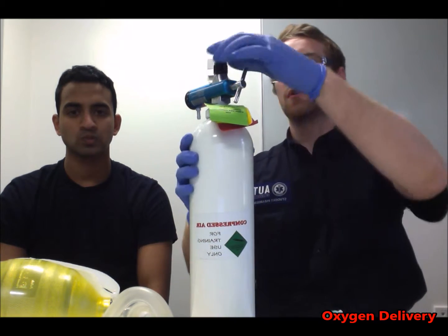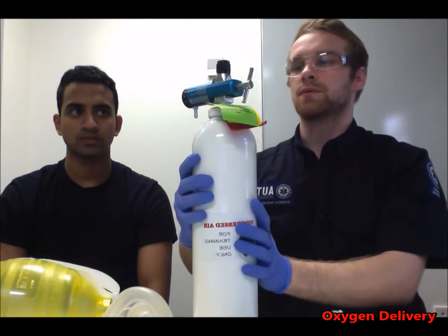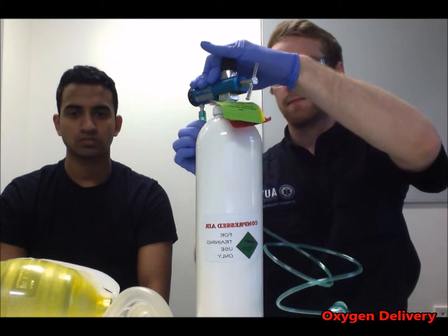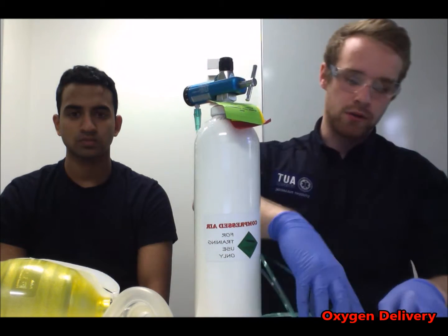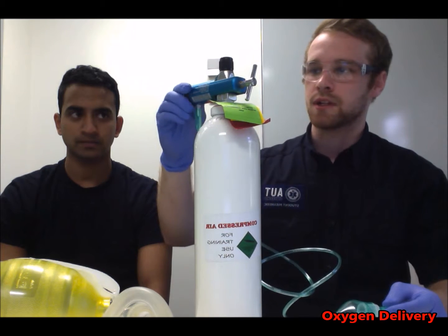Next, you want to check the amount of oxygen in the tank. So you want to turn this on. So this one is half full. Next, you want to attach the tubing, oxygen tubing, onto the tank and onto a mask, and turn it on just to check the flow rates.